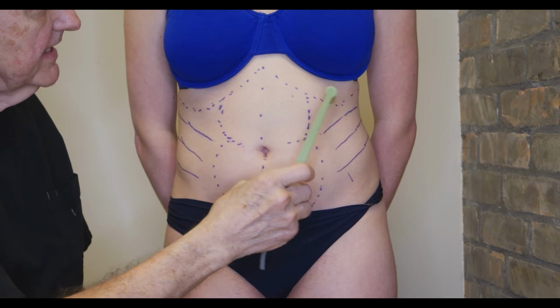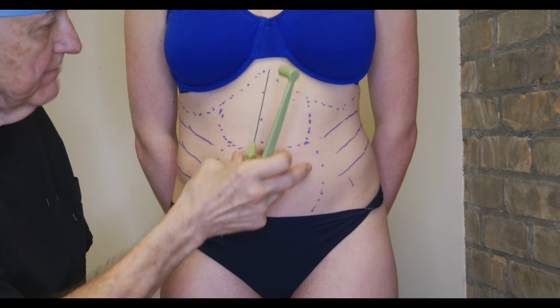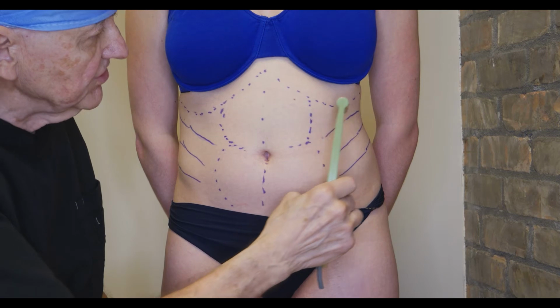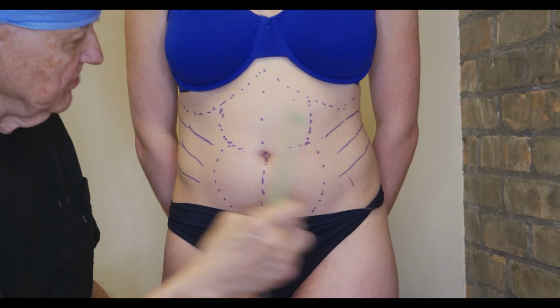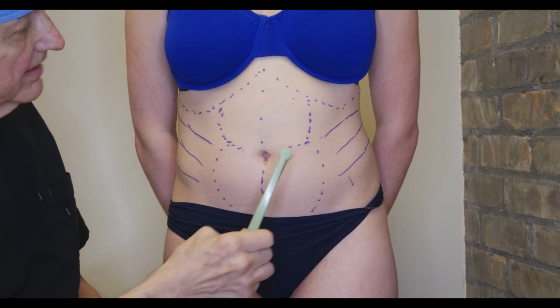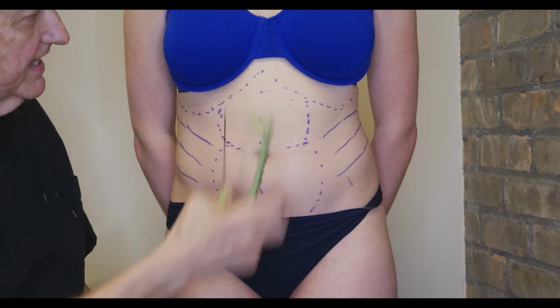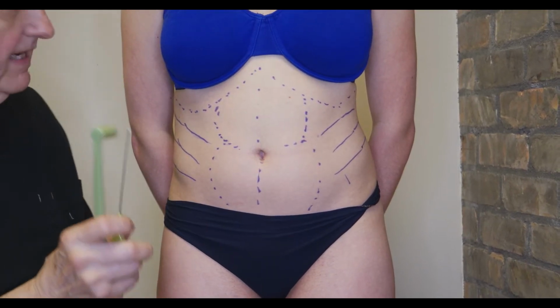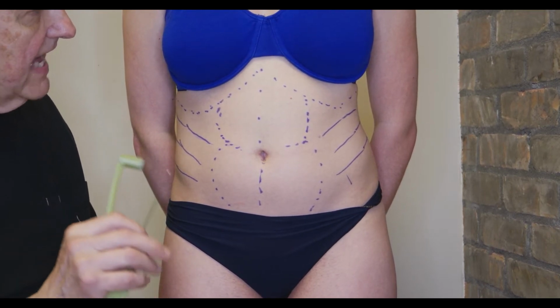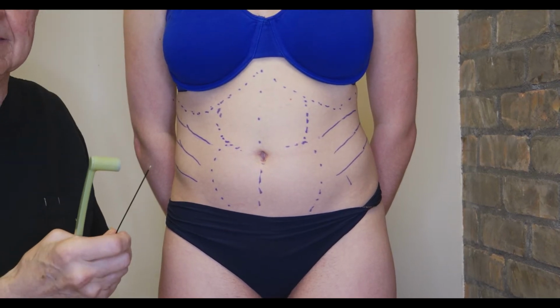We're going to define the lower chest margins. We're going to define the midline abdominal muscles. We're going to define also the lateral muscles and define and improve the waistline and also remove this little bit of bulging in the lower abdomen. This will then allow us to create a very sculptured and contoured appearance to the stomach that we call high definition liposuction with BodyTite.